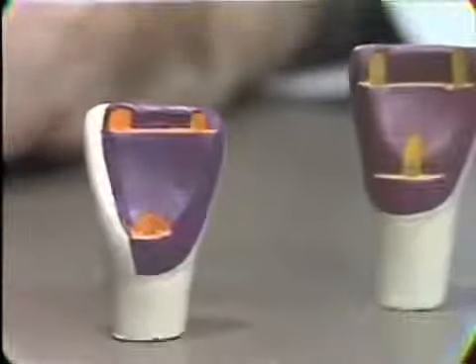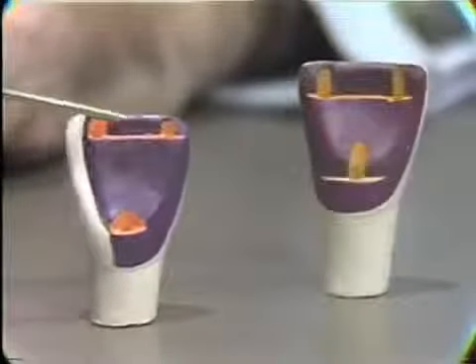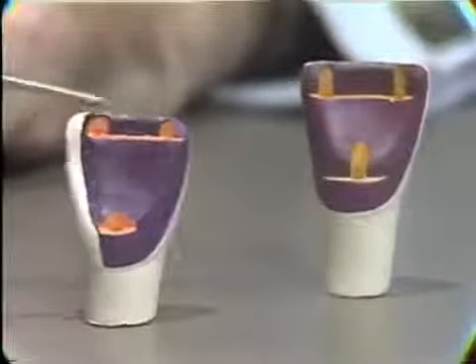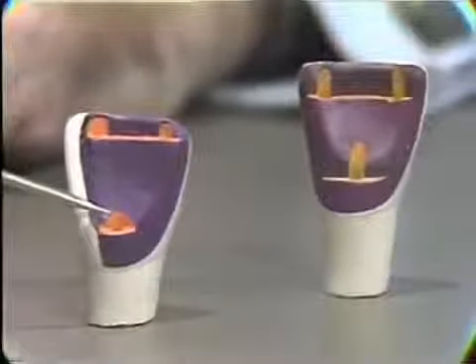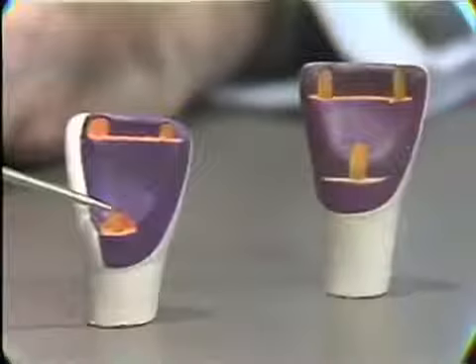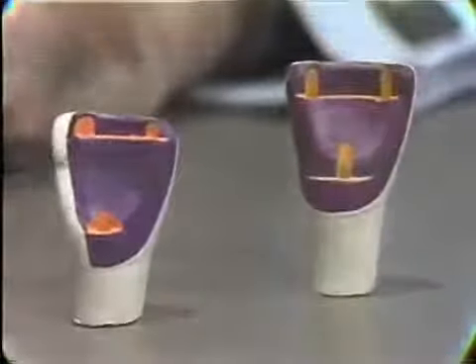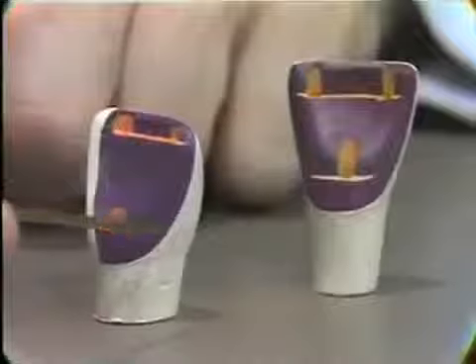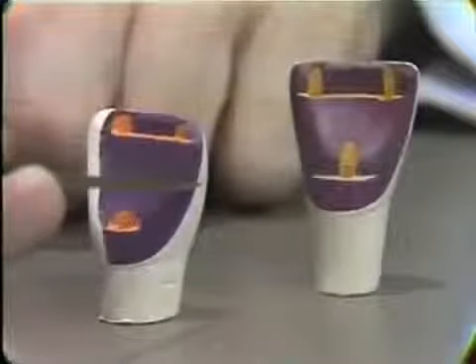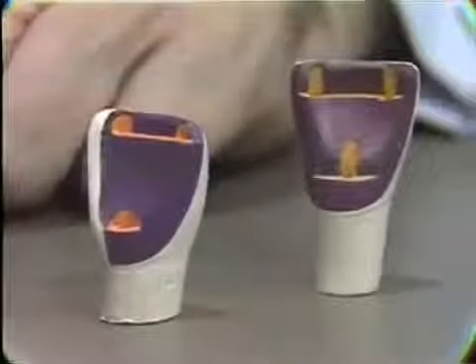The retention in these cases, as we have said, is gained by three pins on the lingual placed in these recesses on either end of the incisal ledge here and in the cingulum ledge down in this situation, and these give the necessary retention, so that the position of the proximal slice here can be modified, can be controlled according to aesthetics, in contrast to the three-quarter crown, where you remember it had to be extended to include the area of the proximal groove.